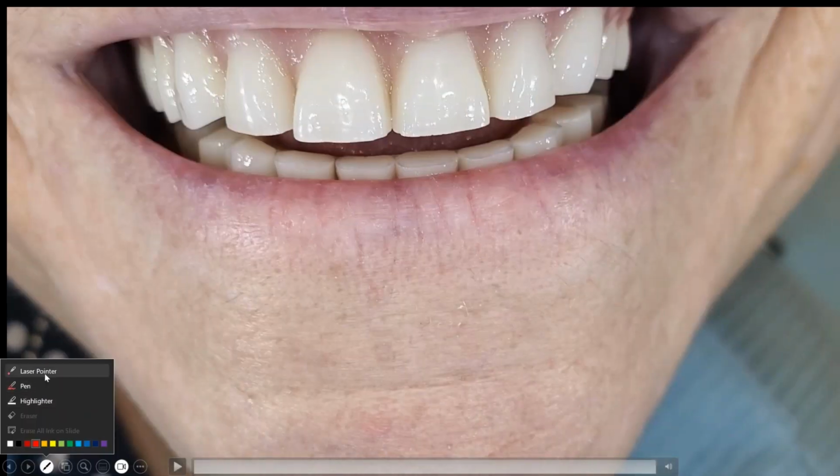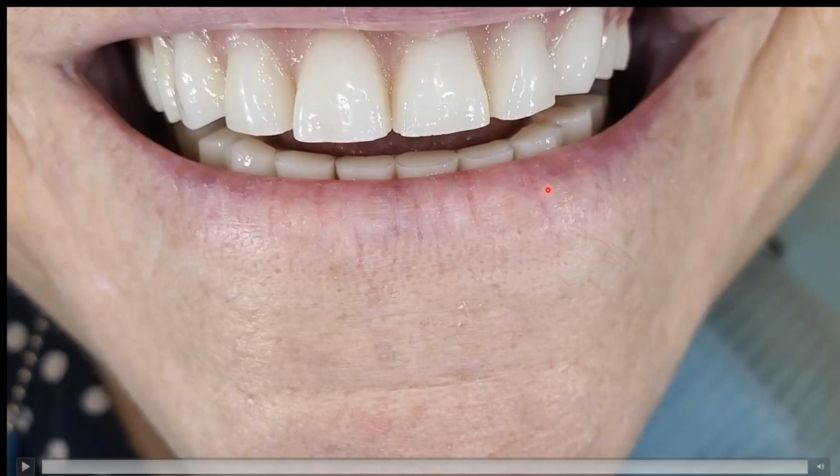So you saw how her jaw postures this way out to her left. So what happens when I rehabilitate this case and I put brand new denture teeth on that haven't been worn down, she's going to want to posture out here. If I keep the same overbite and overjet and anterior placement for all of the teeth, she's going to be breaking teeth on this side because her jaw swings out this way. So when I say the teeth are in the wrong position, I have to keep in mind that this is how her jaw works. It likes to come out to her left. So when I set the denture teeth, I kept that in mind.